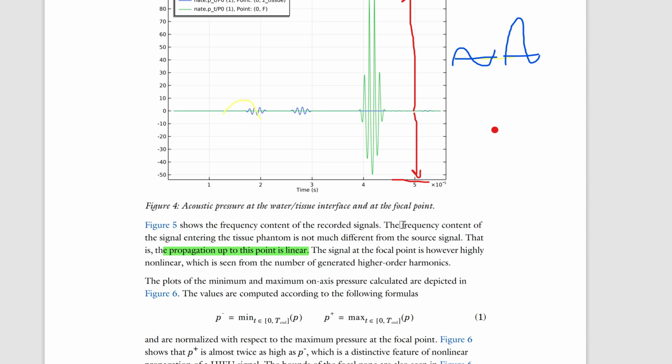The frequency content of the signal isn't different. Okay, frequency content. If this is our footprint, this is our linear footprint, linear frequency content. Nonlinear: the signal at the focal point is, however, highly nonlinear. We have answered that, which is seen from the number of generated higher order harmonics.